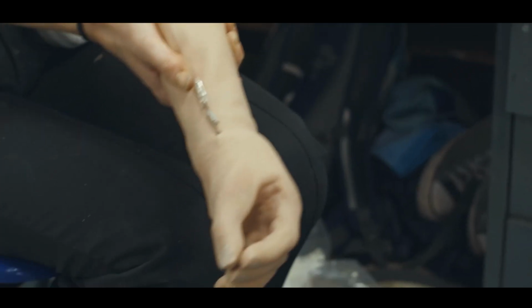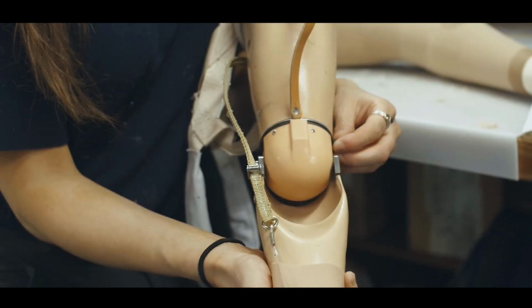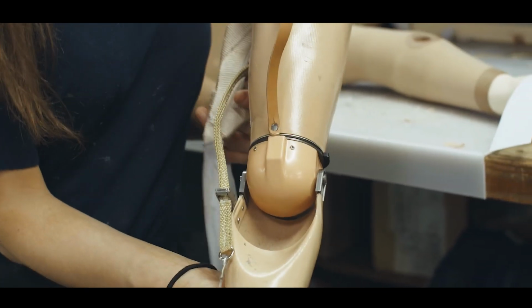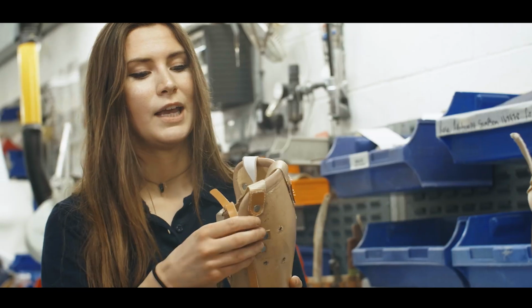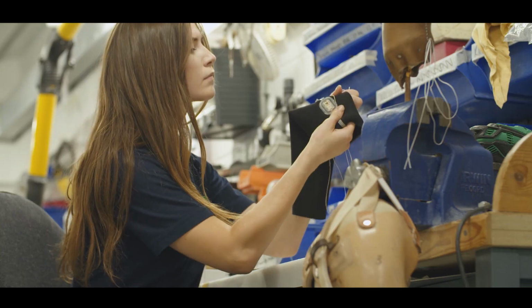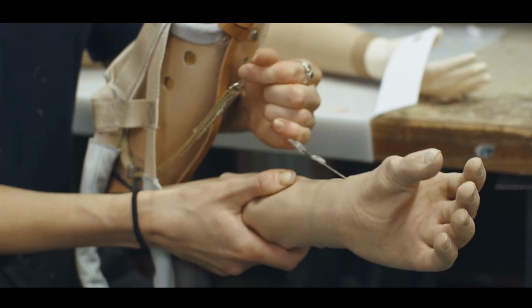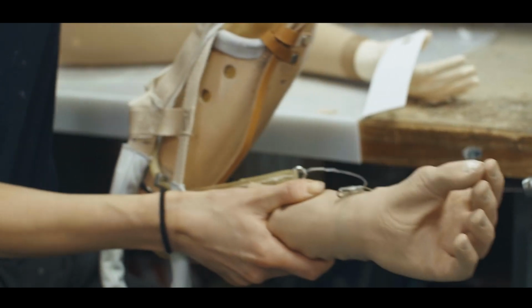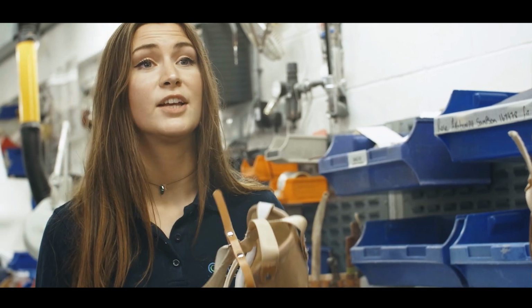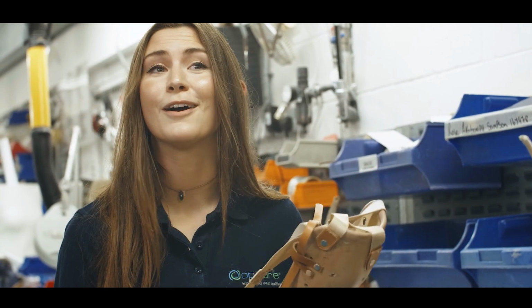This patient is bilateral, so he only has one stump on one side, but he doesn't really have a lot on this side. So it has to be very specific. It has to sit very specifically on him, and that's why we need to tighten and untighten things. And that's why we have all these systems, so that we can make it as easy as possible to work it without jolting. I actually see this man every morning walking through the park on my way to work.